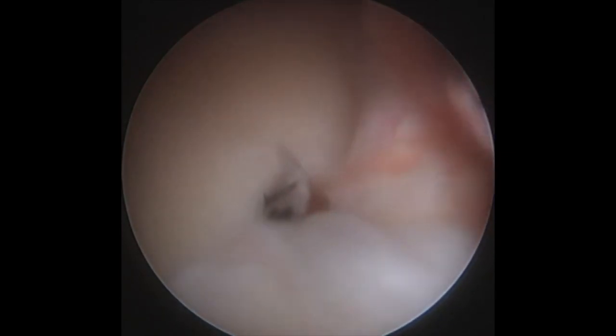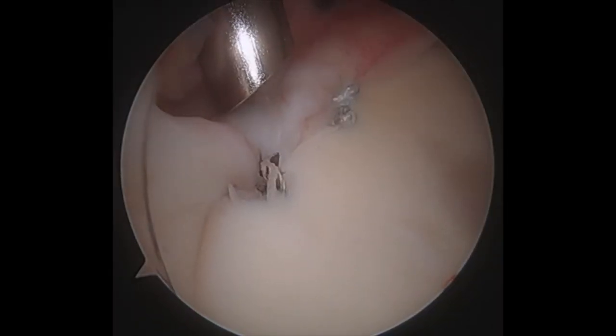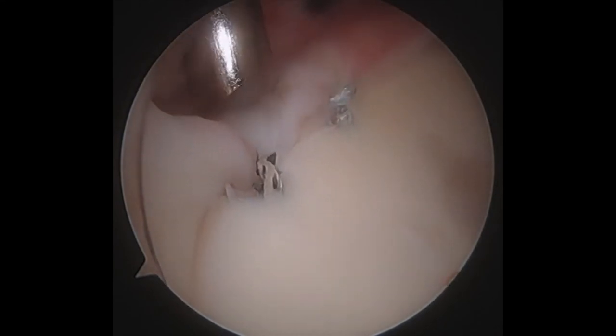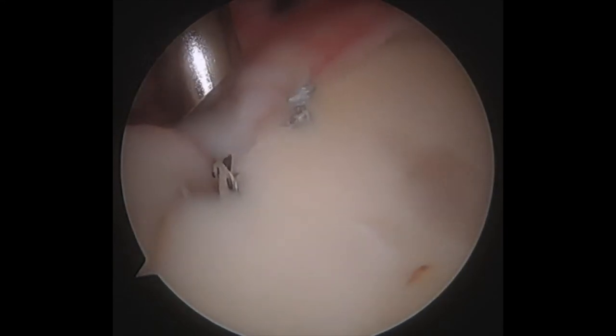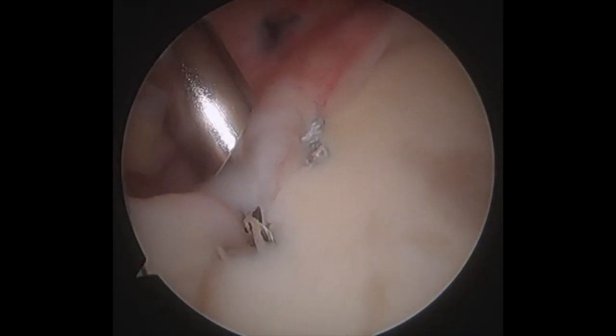This is our final labral repair, which you can see is two suture anchors nicely securing the labrum to the bone. Again, this is the final repair as viewed from an anterior portal. You can see that the labrum is now firmly reattached to the bone and the humeral head is nicely centered on the glenoid, thus accomplishing an anatomic repair.